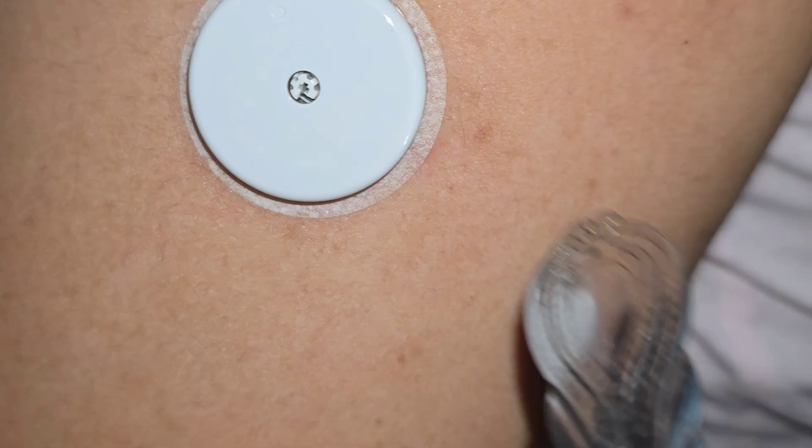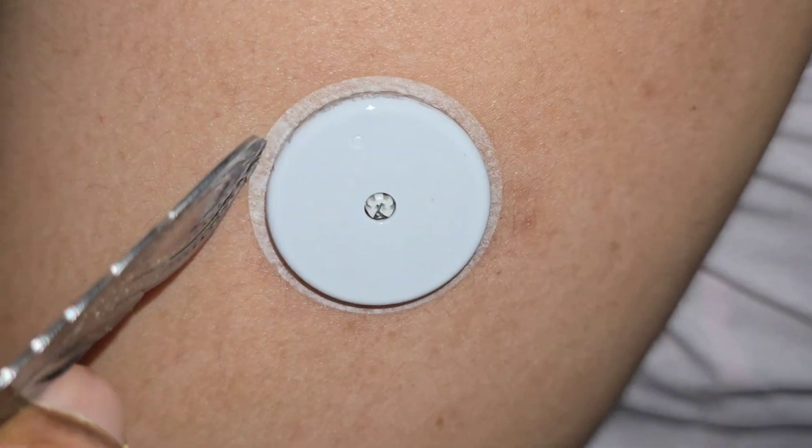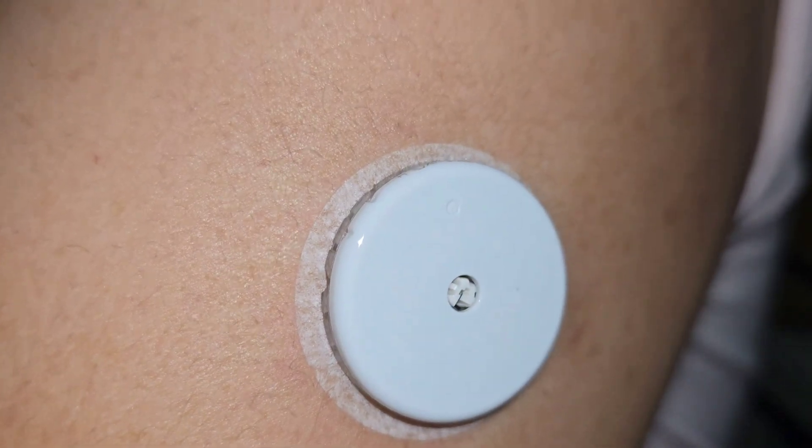This way your sensor will not budge and will stay put for 14 days. I learned this hack long ago and I hope it helps you too. Do let me know in the comments if there is any other way you prefer to put your sensor — it will help a lot of us.